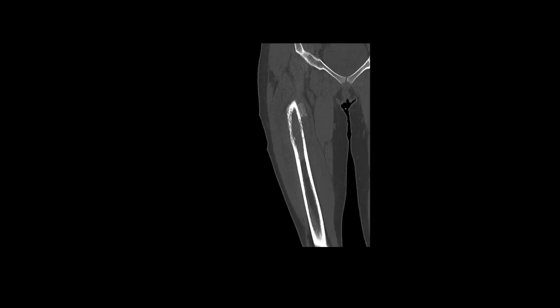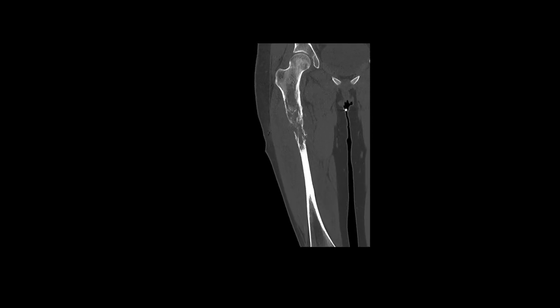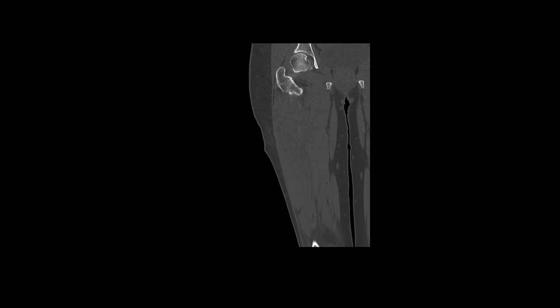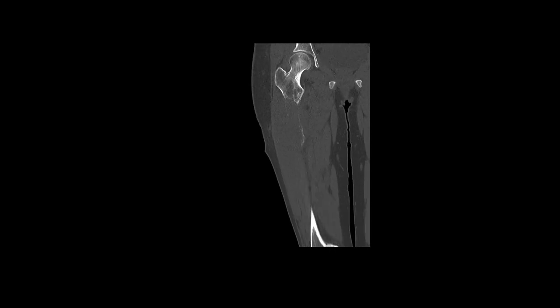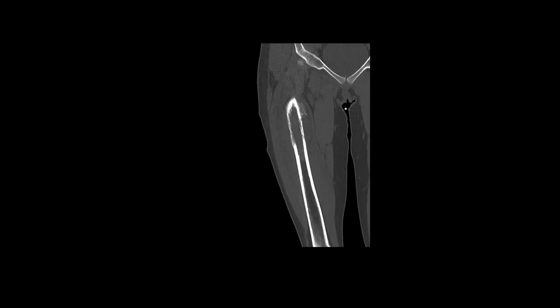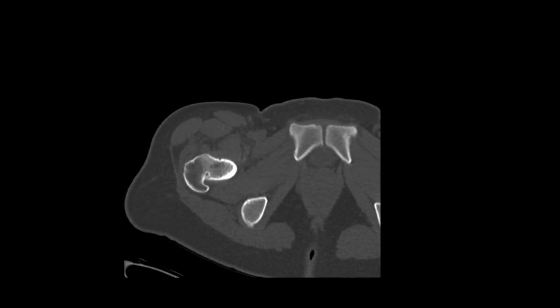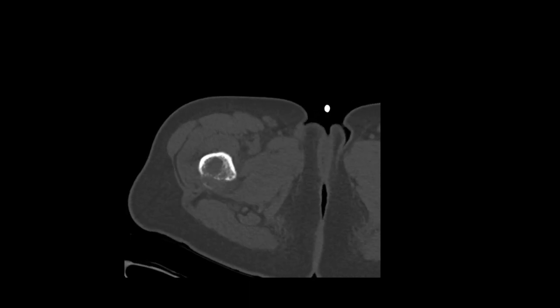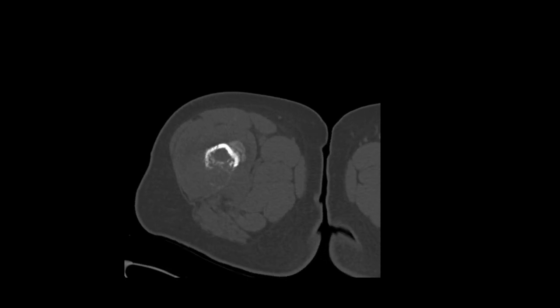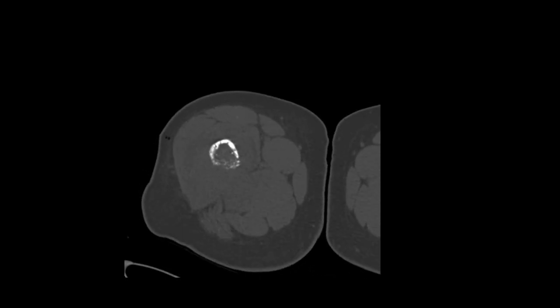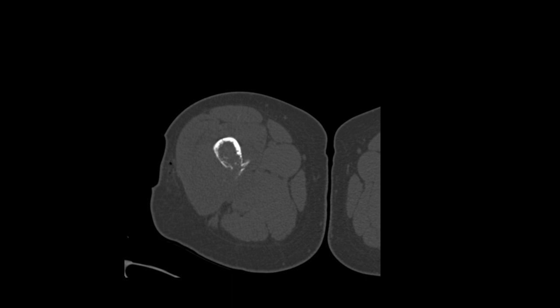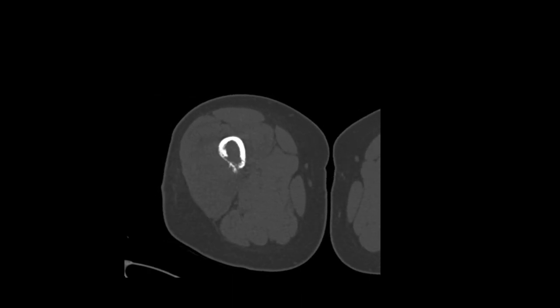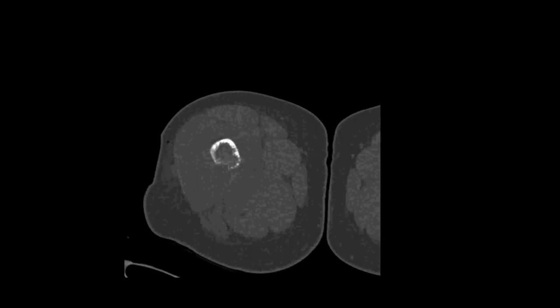CT imaging revealed an aggressive destructive lesion of the proximal intertrochanteric and subtrochanteric right femur with associated soft tissue mass, periosteal reaction, lytic destructive changes, mild surrounding edema, and a few mildly prominent right inguinal lymph nodes. The soft tissue mass involved the anterior compartment musculature, adductor musculature, and involvement of the lesser trochanter at the iliopsoas attachment. A mass effect on the deep femoral artery and vein were also noted.